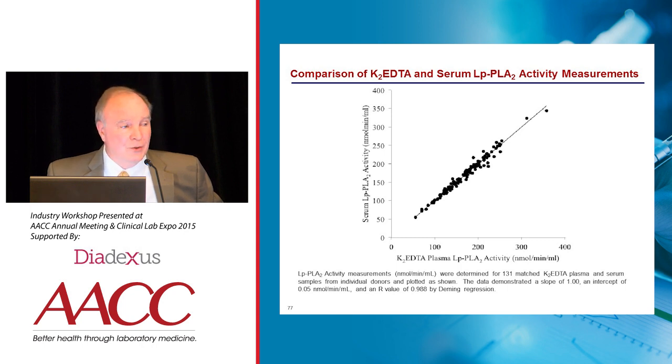We wouldn't want to add on a test on an unspun CBC sample collected in EDTA, but if that sample was spun and separated pretty rapidly, we could perhaps consider adding it on. We're storing our serum now in a refrigerated stockyard on our automation system, so we could certainly add it on to serum. And it turns out we have similar results on lithium heparinized plasma.